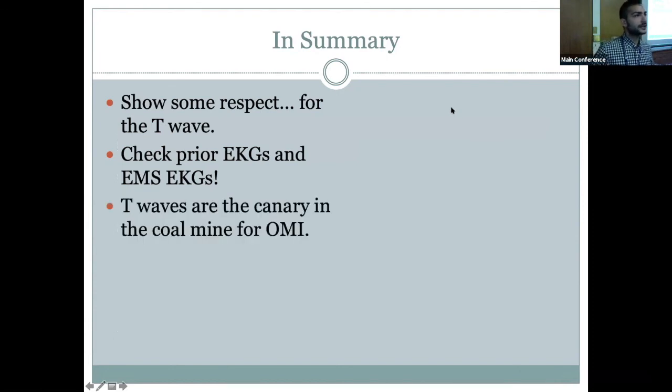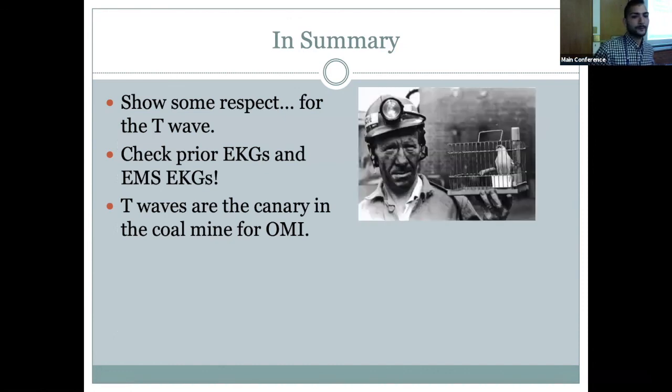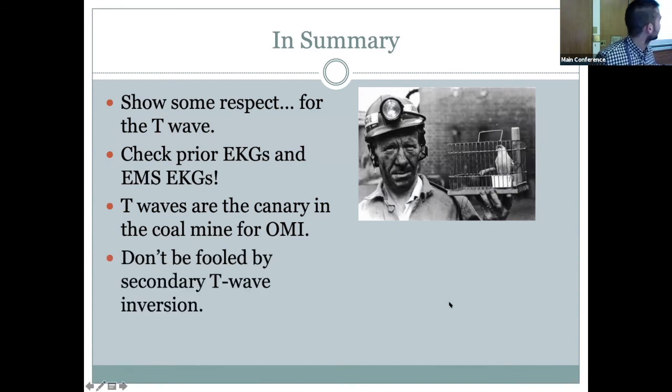T waves are the canary in the coal mine for acute occlusion MI. That's the canary, and that's the coal miner. So the canary's like, oh, it's arteries occluding. And the coal miner's like, oh, I better call the cardiologist.